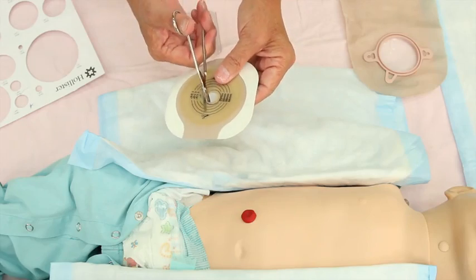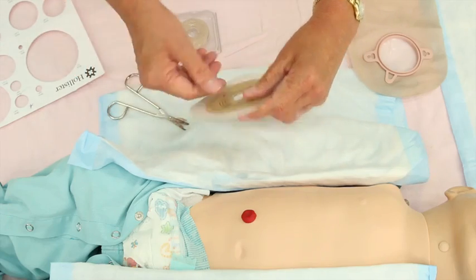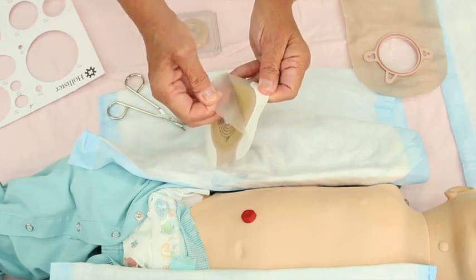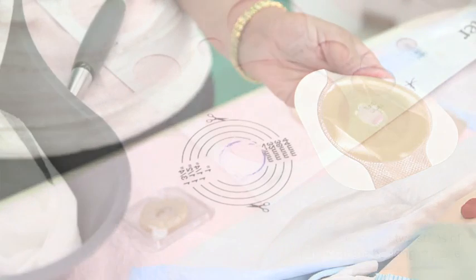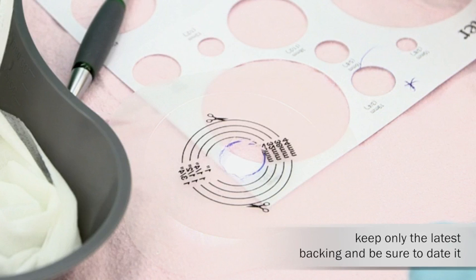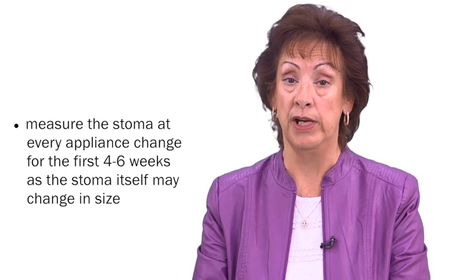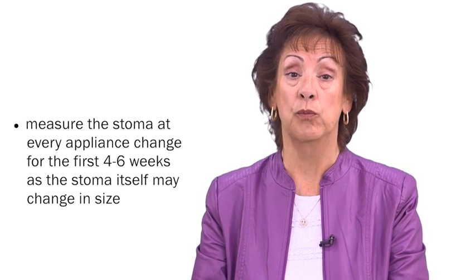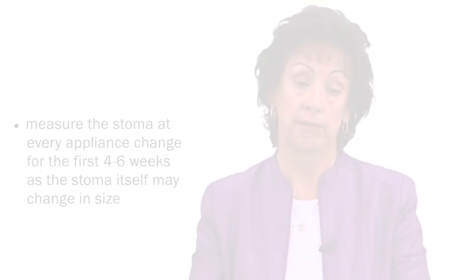Cut out the traced circle in the skin barrier flange. Remove the plastic backing from the skin barrier and set it to the side. Leave the 2 strips of paper on the backing in place. The plastic backing may be kept as a template in the box of supplies, but be sure to keep only the latest one and date it. It is important to measure the stoma at every appliance change for the first 4 to 6 weeks, as the stoma itself may change in size.